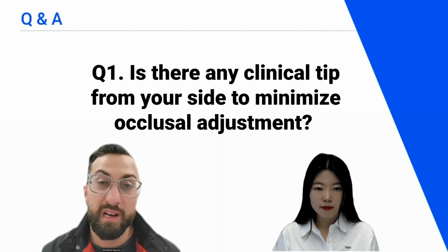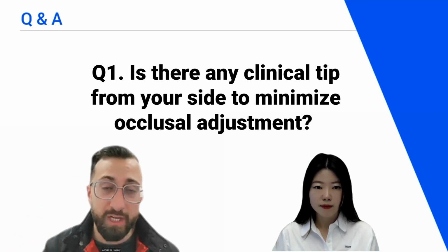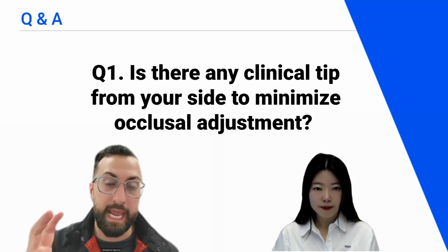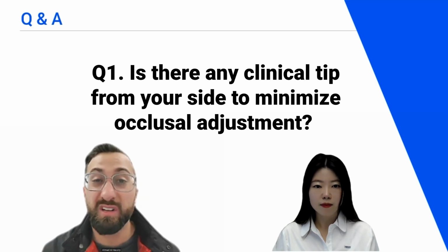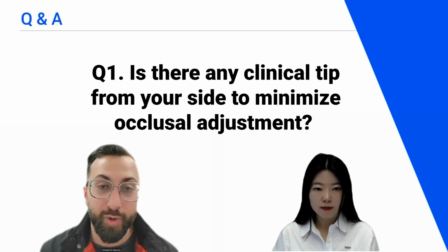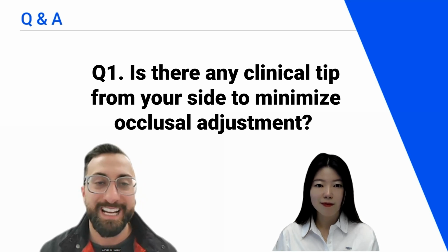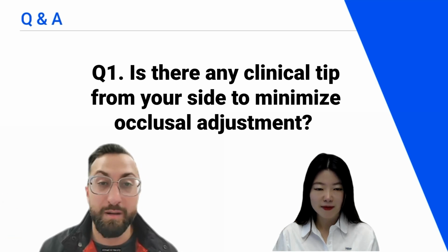So what I would really suggest is that when we take our bites, we check, make sure you've aligned it properly, and always check by rotating the scan that there's not a lot of intersections. And honestly, I just make it routine to scan both sides of the bite, and that solves most of my issues. If you do all of that and you're sure your data is correct and you're still getting high crowns, I'd have a chat with your lab and try to troubleshoot why that is happening, because it also comes down to design and manufacturing.